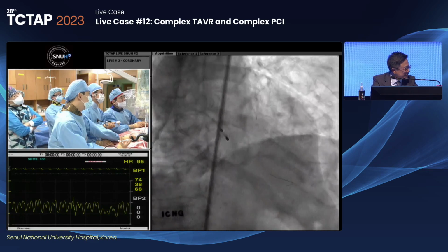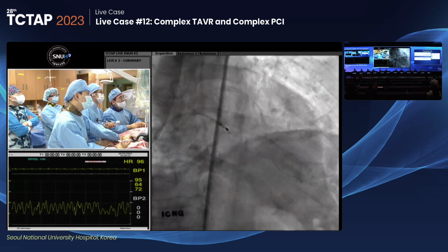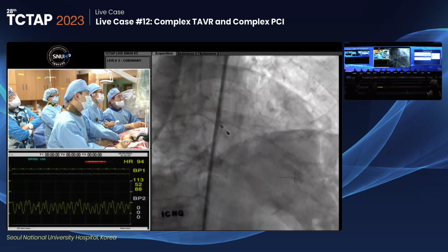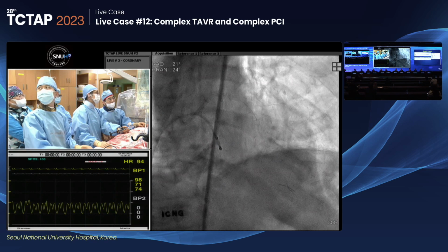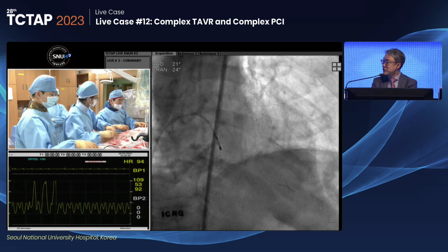Antonio, you recommend the small size balloon, 1.0 or 0.9 millimeter? Dr. Kim, advance your 1 millimeter balloon. The guiding catheter was small. Watch out for the guide, watch out for the wire, don't lose the wire. Shall we change the guiding catheter? And make sure that the wire is hydrophilic and doesn't perforate. Guidezilla, okay, Guidezilla please. So Antonio recommended the small size balloon.